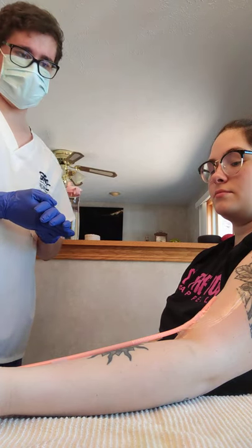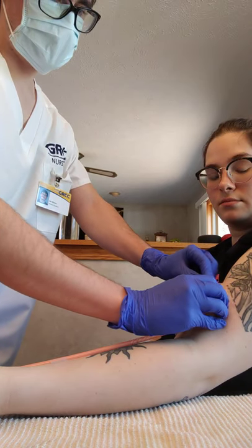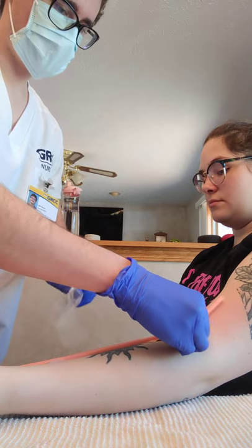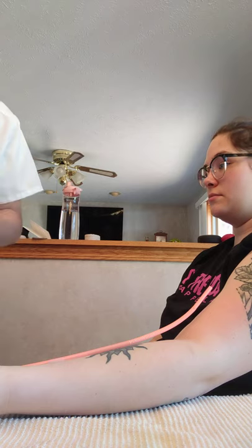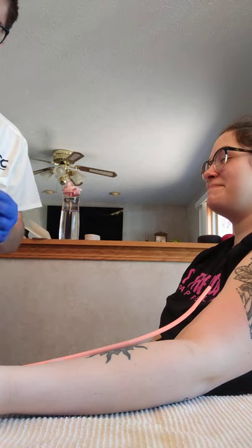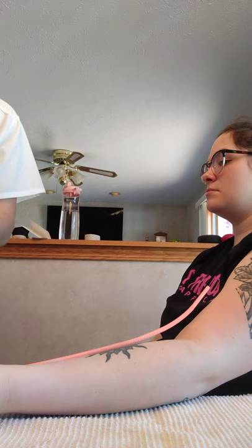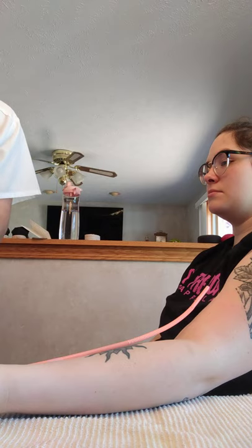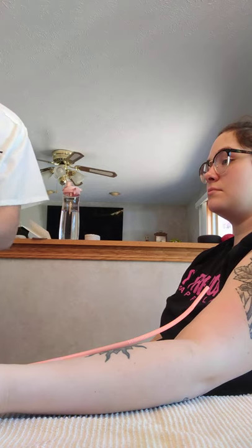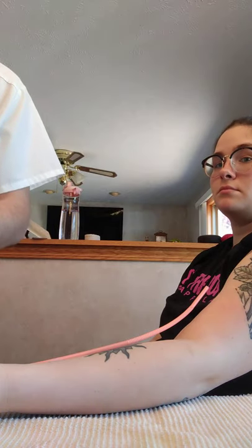So now I'm going to take off the old dressing, starting at the hub of the catheter, and take it off perpendicularly. Discard the old dressing, and now I'm going to discard my gloves. And now I'm going to simulate washing my hands again, and I'm going to don my sterile gloves.